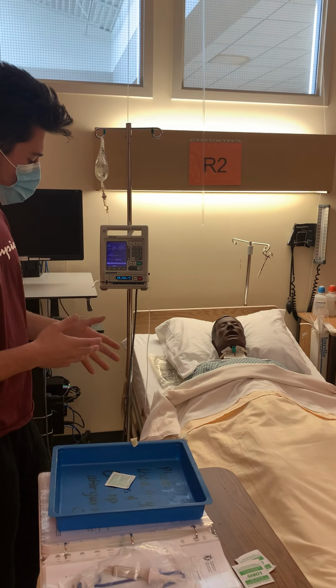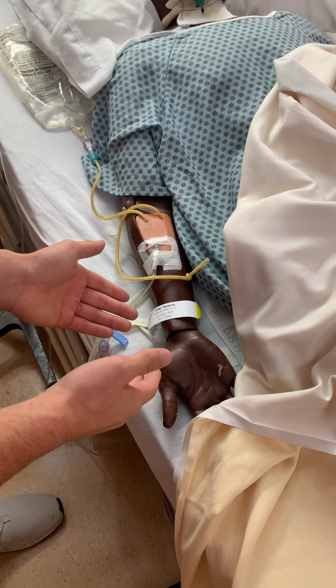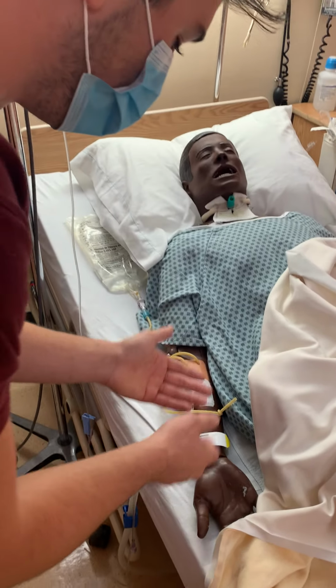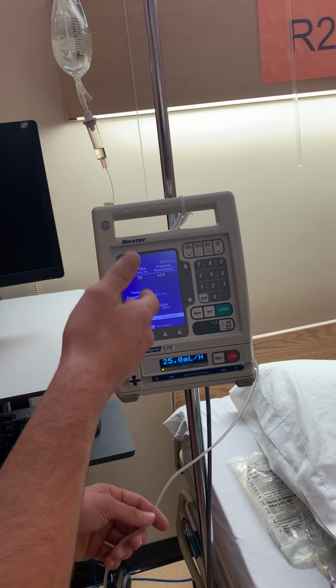To start off, I'm going to look at their IV site so I can assess it and see that there's no complications. I'm looking for phlebitis, erythema, any IV complications, and I can see that there's none and everything is infusing well. Are you in any pain? No. So they don't have pain there, and I can see that all my clamps are open and everything is infusing properly.